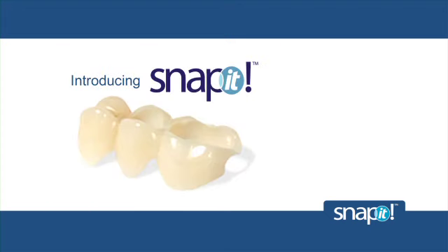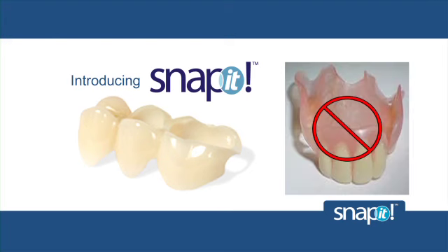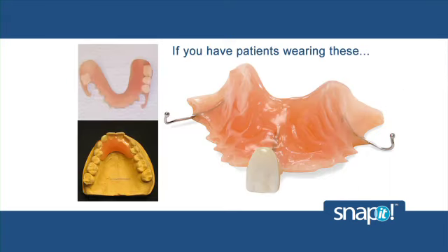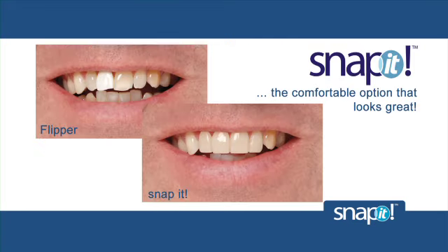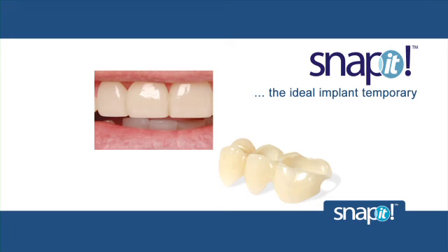In addition to Snap-On Smile, you can offer your patients the Snap-It device. Snap-It can be ordered as just a quadrant or even for a single tooth. It replaces the need to use an old-fashioned flipper and fits your patient in exactly the same way as Snap-On Smile, without covering the palate or the gums and without using wire retainers. Snap-It is the ideal implant temporary and is a better choice for both dentist and patient.